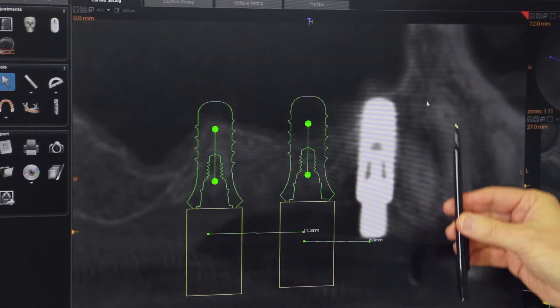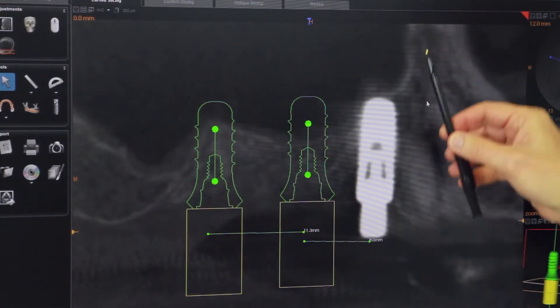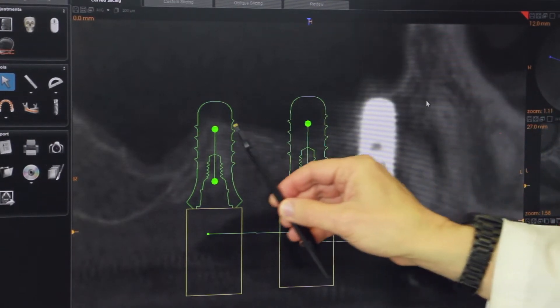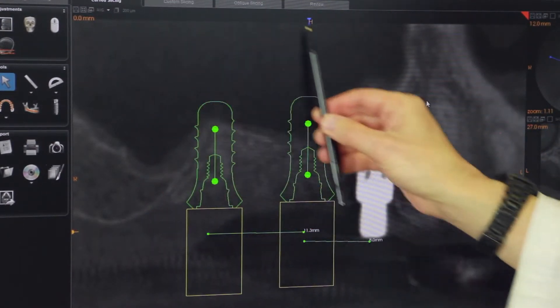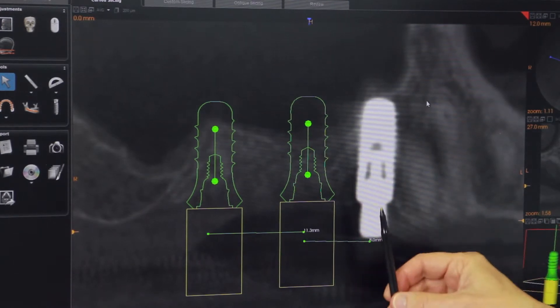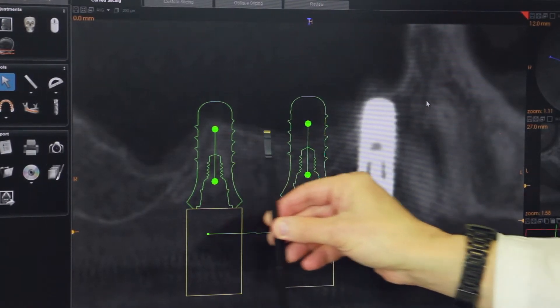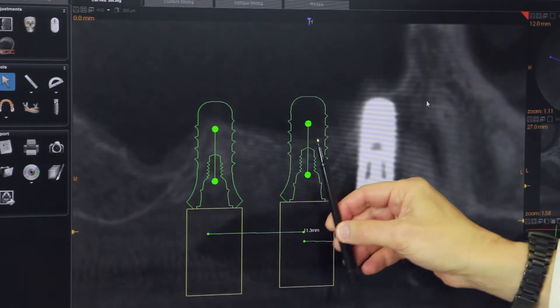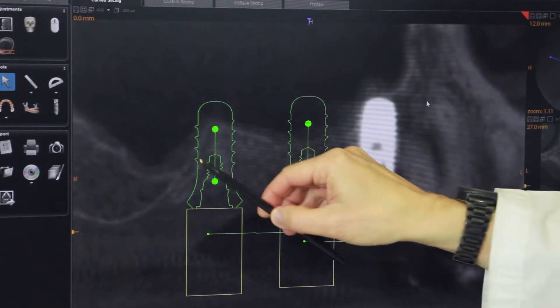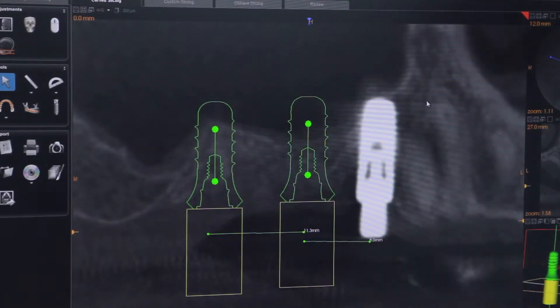Equally as important is this scan of the upper jaw bone, which clearly delineates the borders of the maxillary sinus, which is an air cavity. As we can see here, if we put our implants in virtually, we can see that they would protrude into the sinus. We wouldn't know this without a three-dimensional scan.